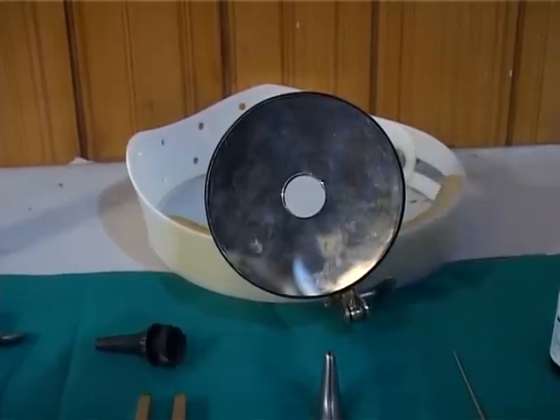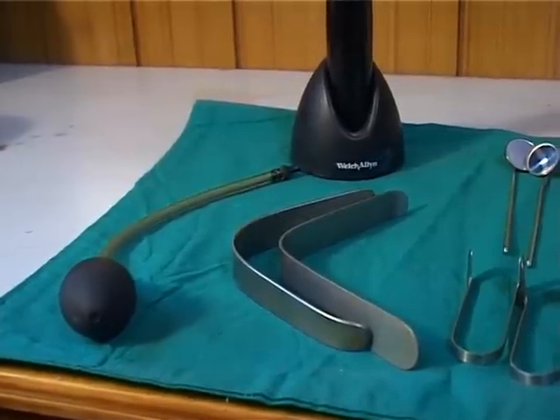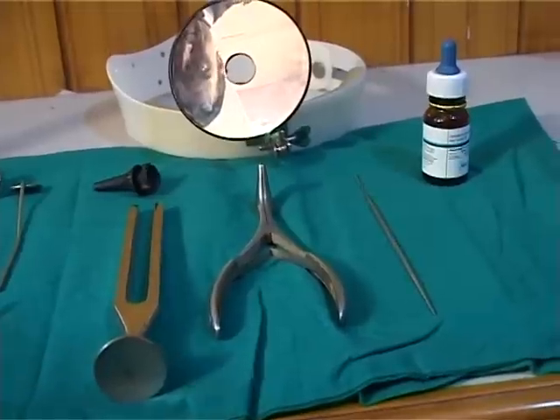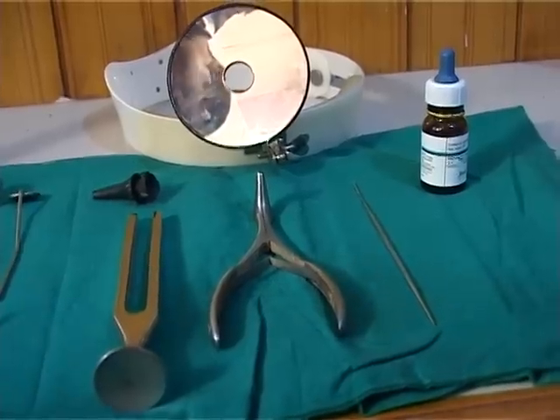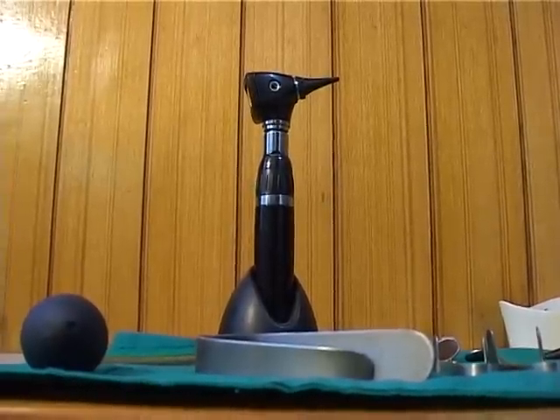These instruments are: ear speculum, nasal speculum, tongue depressors, indirect laryngoscopy mirrors, posterior rhinoscopy mirrors, spirit lamp, Jobson Horne ear probes, nasal and oral forceps, Siegle's speculum, tuning forks (512 Hz is commonly used), and an otoscope with good illumination.